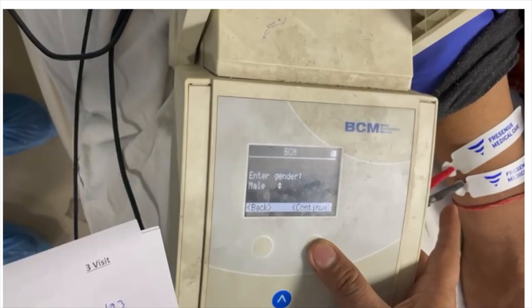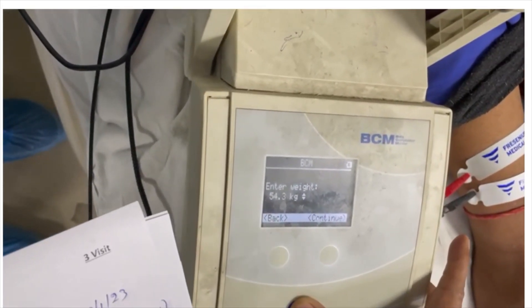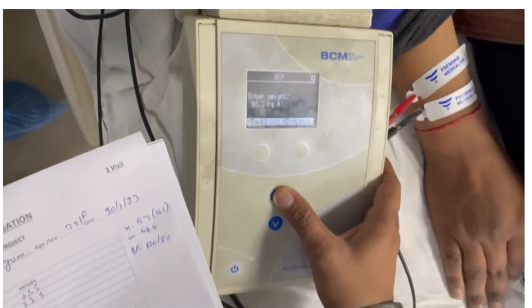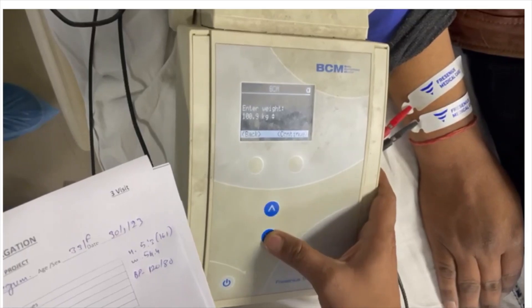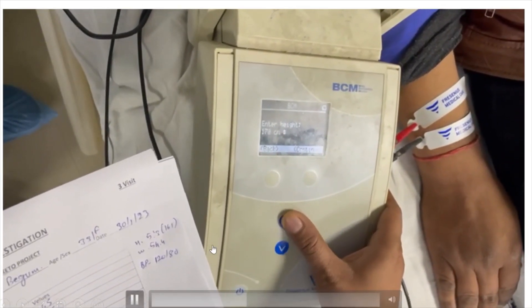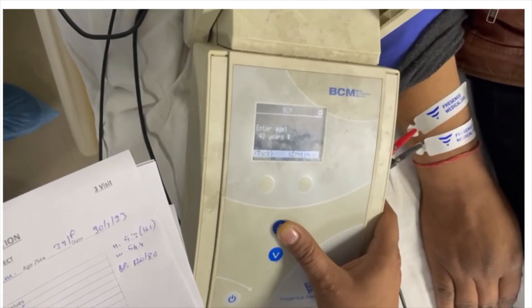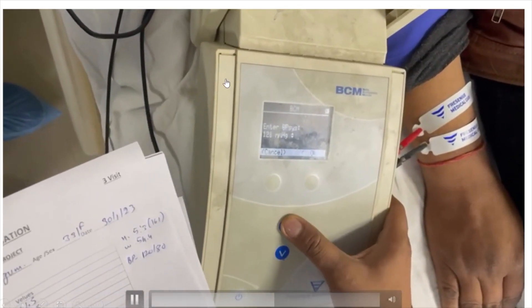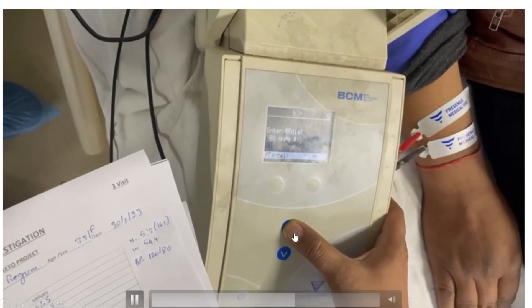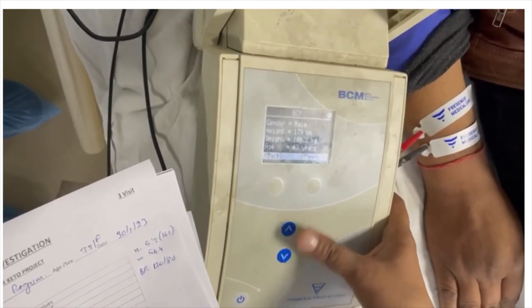First we enter the patient's gender, then patient weight, followed by height. We also enter the patient's systolic blood pressure, diastolic blood pressure, and the planned ultrafiltrate volume if the patient is on dialysis. Weight is entered in kilograms and height in centimeters. Then age is entered. Using the four buttons — one for continue and others for adjusting values — we enter the age, systolic BP, and planned ultrafiltrate. Once everything is entered, a summary screen is displayed.